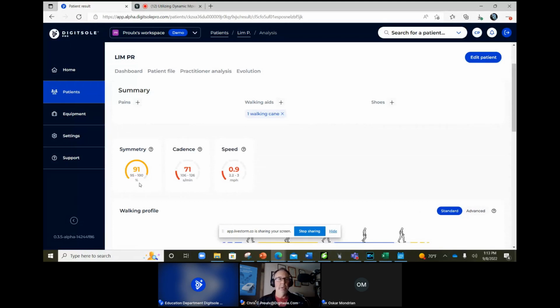As we start to approach a 10% difference between the right and the left, we get more concerned because that is an indication that there's an actual condition or pathology. So we see that we're in the orange and we're getting close to that point. At least when I see it in the orange, I'm going to think about that. I'm going to put it in the back of my mind as I continue to move through this.